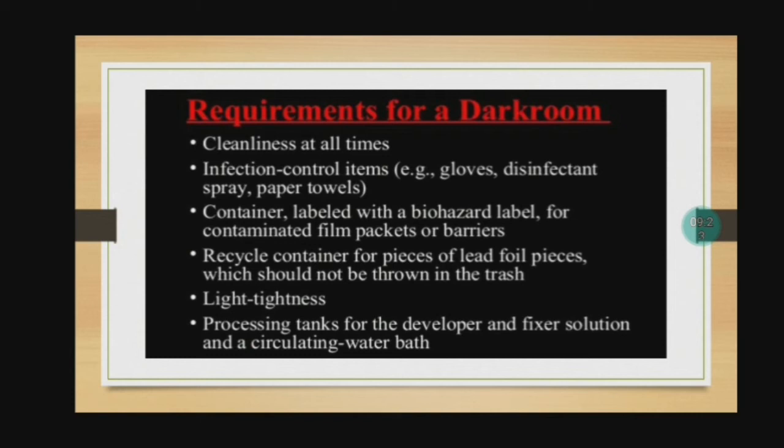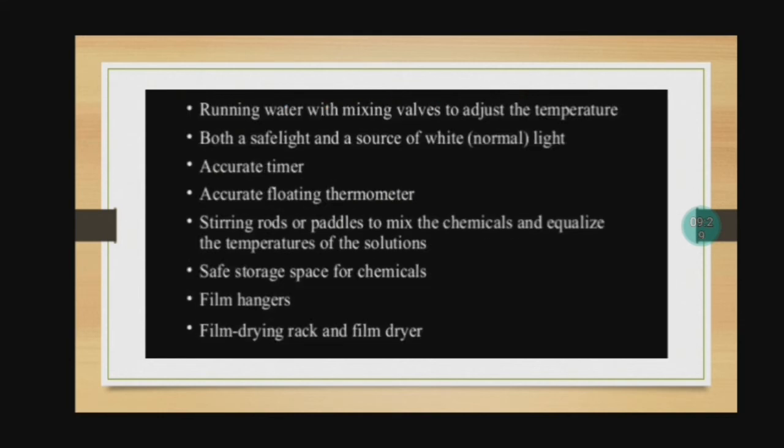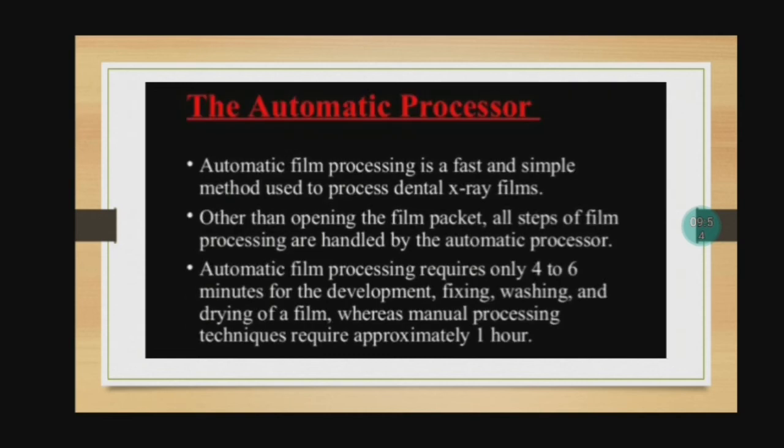Light tightness, processing tanks for the developer and fixer solution, and a circulating water bath. Running water with mixing valves to adjust the temperature, both a safe light and a source of white light to produce normal light. So accurate timer, accurate floating thermometer, stirring rods or paddles to mix the chemicals and equalize the temperatures of the solutions, safe storage space for chemicals, film hangers, film drying rack, and film dryer.